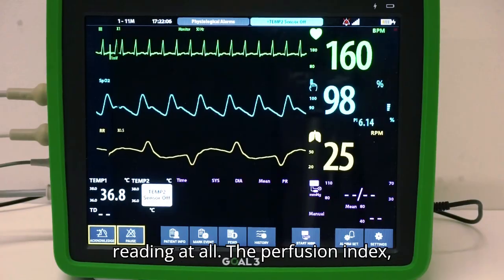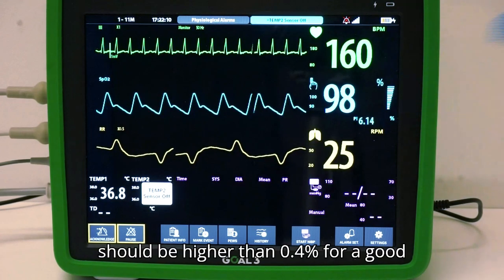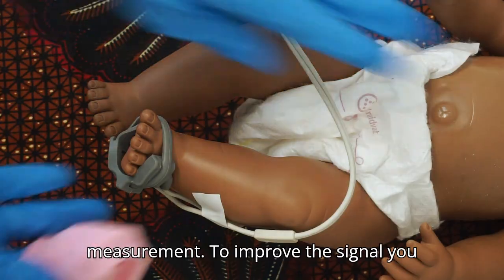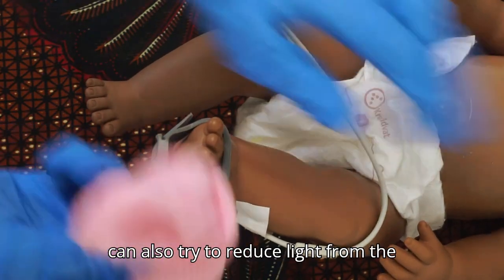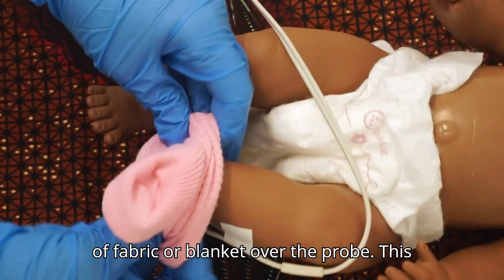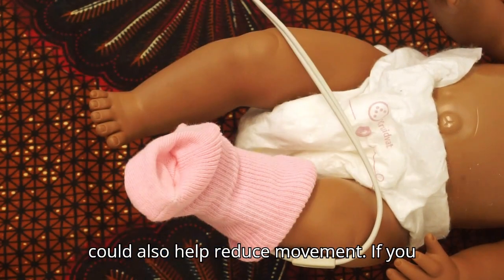The perfusion index, shown as Pi below the oxygen saturation, should be higher than 0.4% for a good measurement. To improve the signal, you can also try to reduce light from the environment by placing a sock or a piece of fabric or blanket over the probe. This could also help reduce movement.